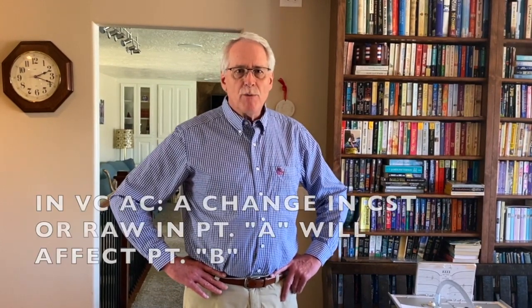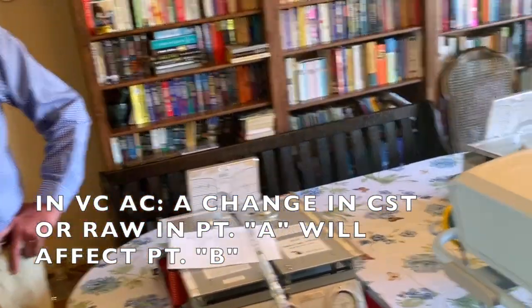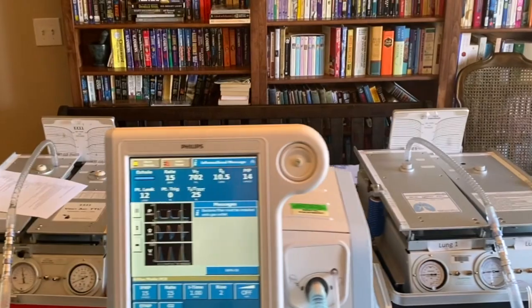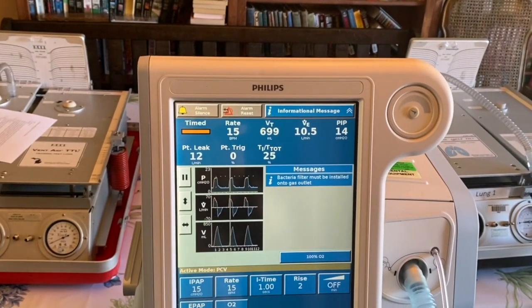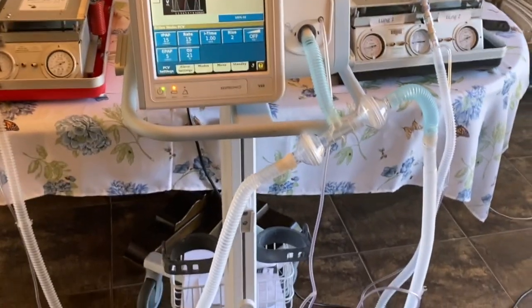In volume control ventilation, if there's a change in compliance or resistance in patient A, patient B will get more volume or less volume depending upon what happens with patient A. However, if you have a change in compliance or resistance in patient A using pressure control, patient B is completely unaffected by patient A's compliance or resistance.